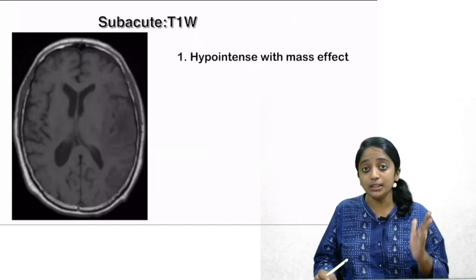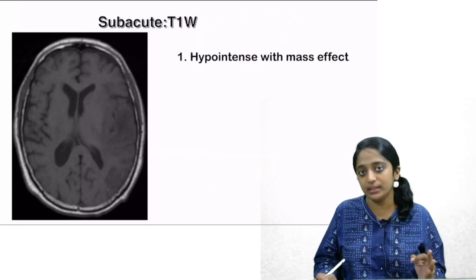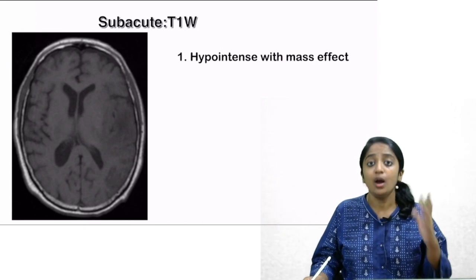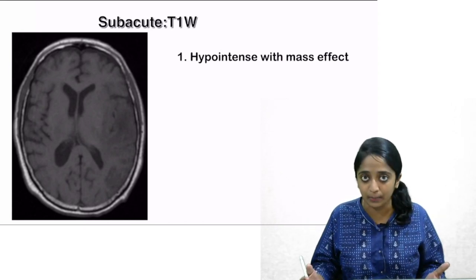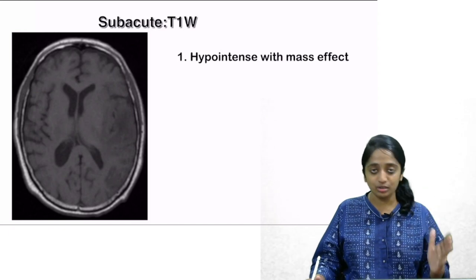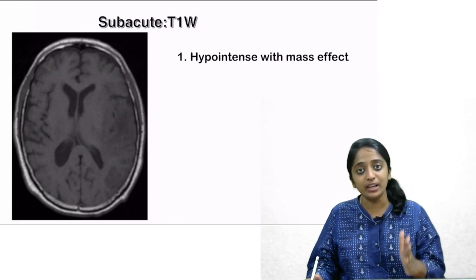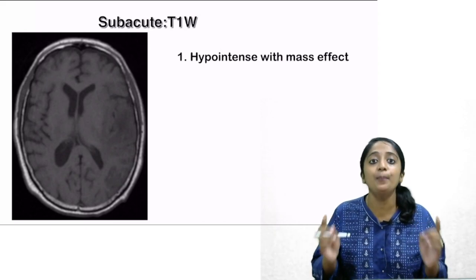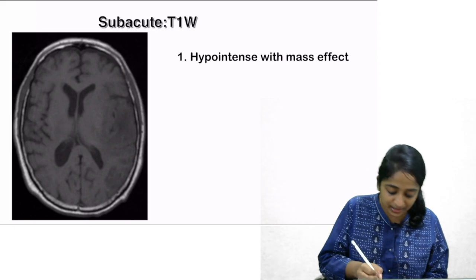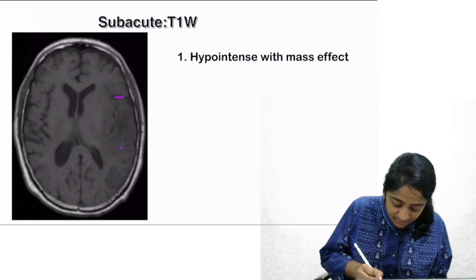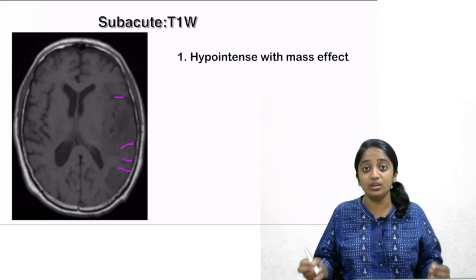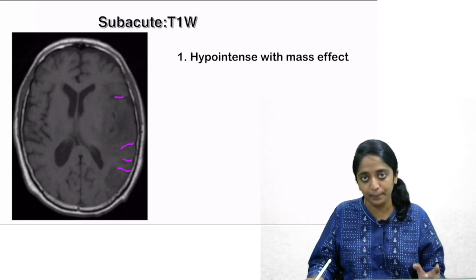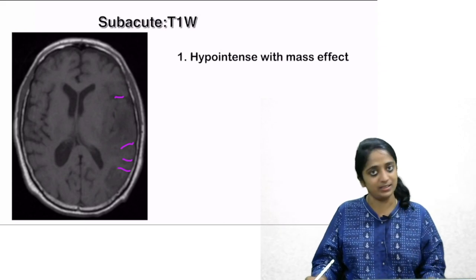In subacute infarct, what do you expect in T1-weighted imaging? Three things. First, you can expect hypointense areas with mass effect. Why hypointensity? It is due to vasogenic edema. To begin with, you had cytotoxic edema; now, with breakage of the blood-brain barrier, you are going into vasogenic edema. So it appears hypointense in T1. The mass effect is seen as cortical sulci being effaced — the brain parenchyma is swollen and hypointense.